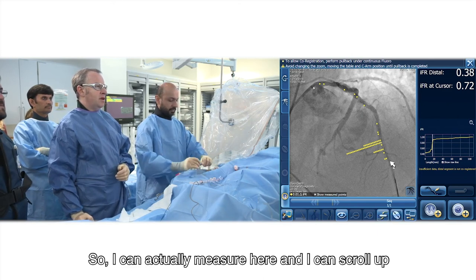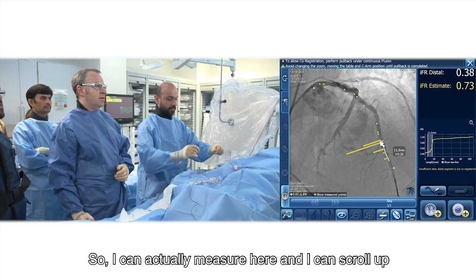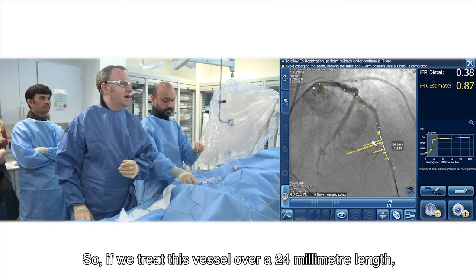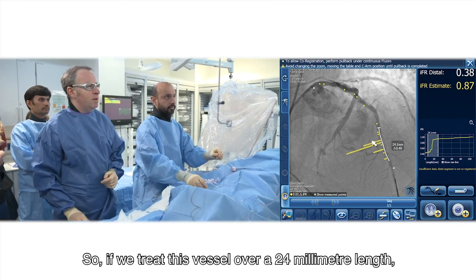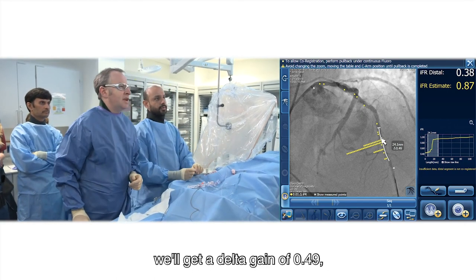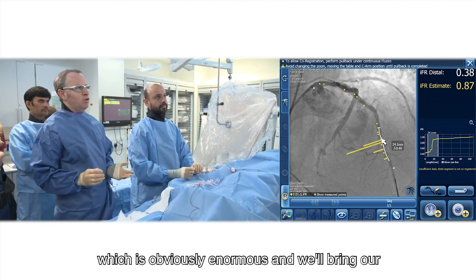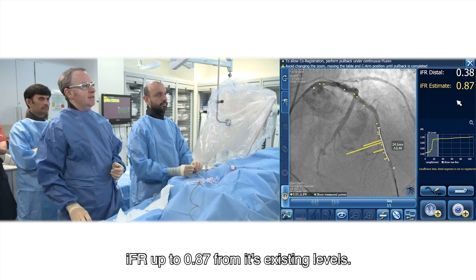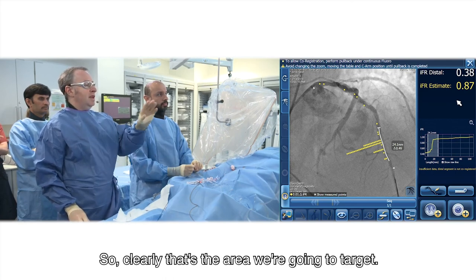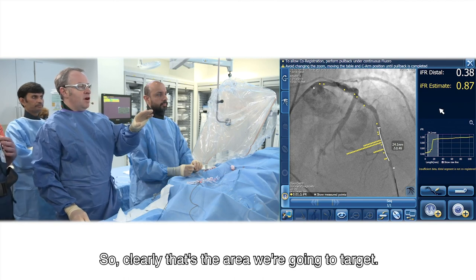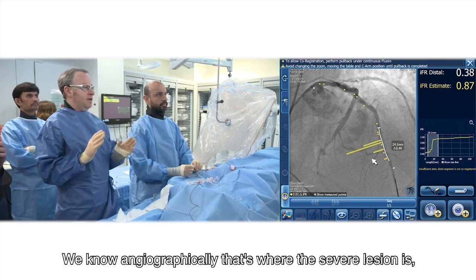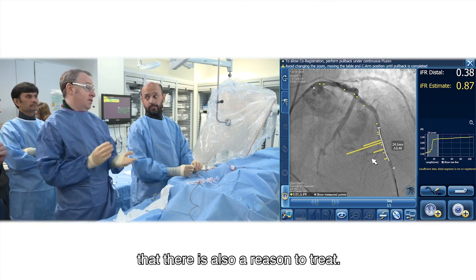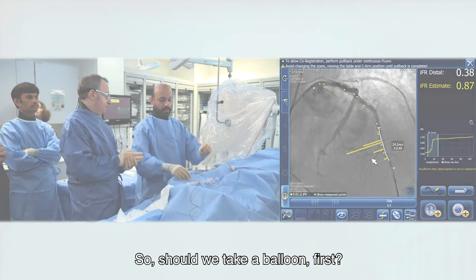So I can actually measure here, and I can scroll up starting to cover that sort of area. So if we treat this vessel over a 24mm length, we'll get a delta gain of 0.49, which is obviously enormous, and we'll bring our IFR up to 0.87 from its existing level. So clearly, that's the area we're going to target. We know angiographically that's where the severe lesion is, but we've demonstrated quite nicely physiologically that there's also reason to treat. So should we take a balloon first?